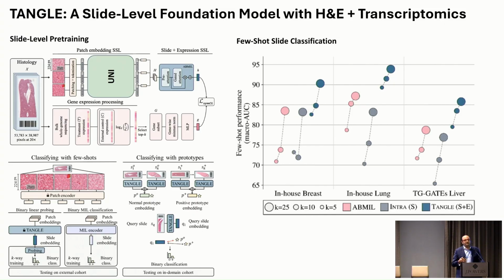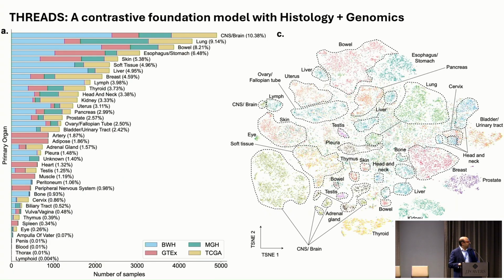So we were able to improve representation quite a lot, where few shot performance drastically shot up for some of these difficult tasks. We looked at breast cancer and lung cancer subtyping, but also toxicology assessment in rodents. So this was the first indication that we should really scale this idea of contrasting with molecular data. So that's what we did next.